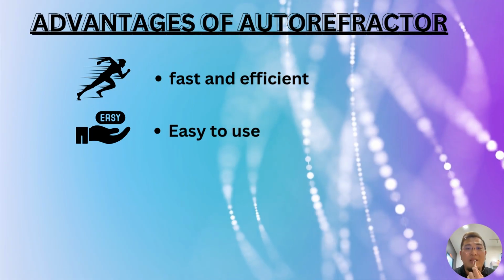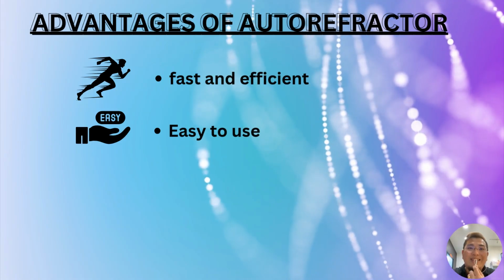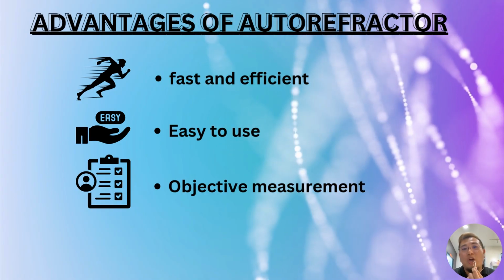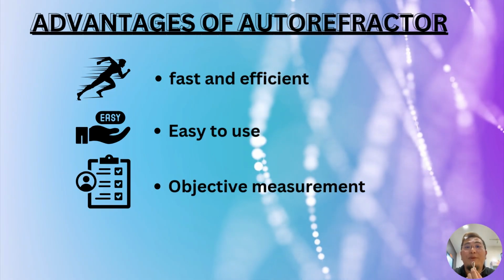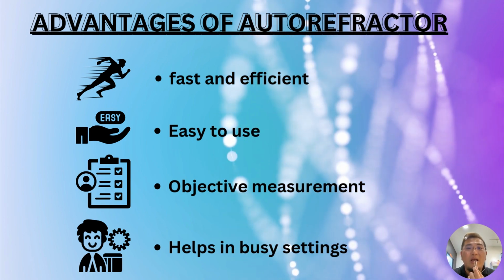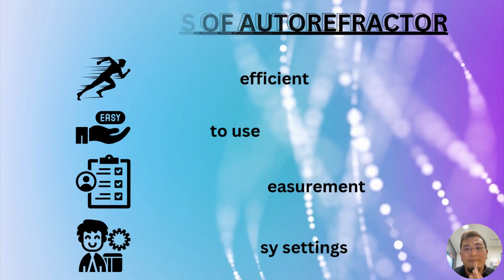This is especially helpful for children, the elderly, and patients with communication difficulties, since it doesn't rely on the patient's response. The autorefractor provides an objective and consistent reading, a reliable starting point before performing subjective refraction. It is useful in high volume settings such as clinics, hospitals, and community outreach. It saves time and increases patient flow efficiency.